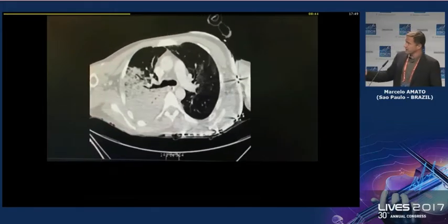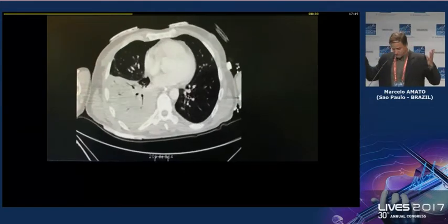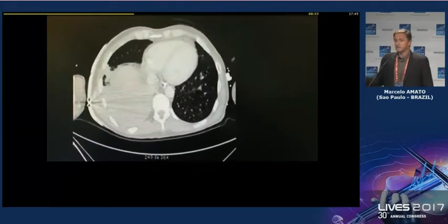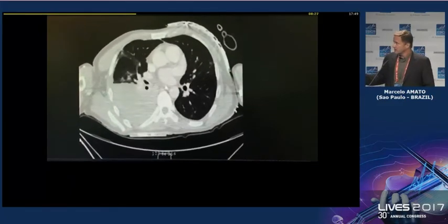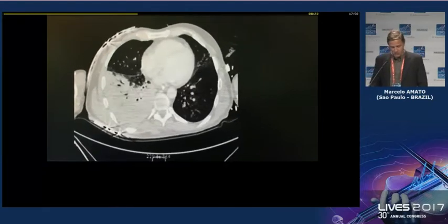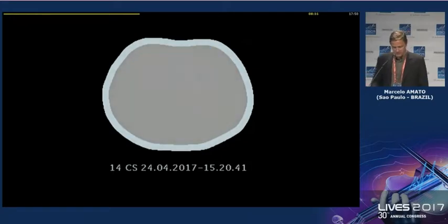In some other cases like this, the patient had a severe pneumonia, was very septic, but to the surprise of everyone, there was no hypoxemia. The patient was under 21% oxygen. And then everyone was a little bit surprised about this, and a little bit in doubt whether this was really a pneumonia. And then we did a ventilation map, clearly showing that there was a big defect here.